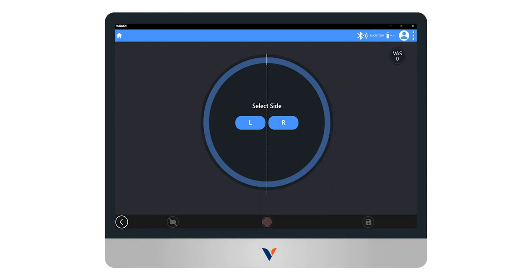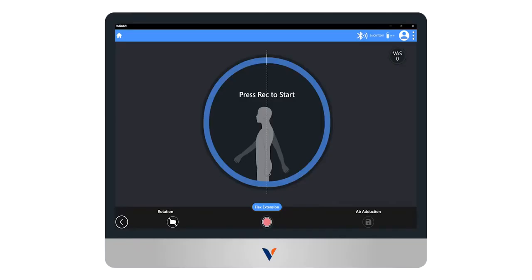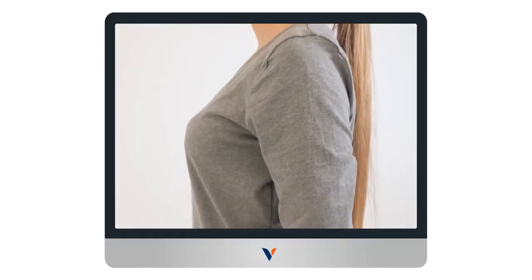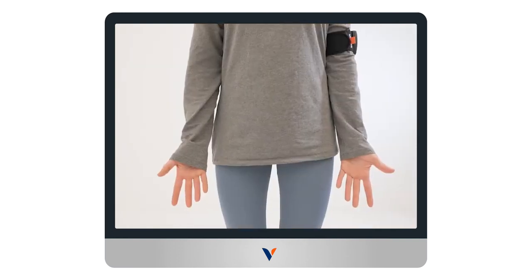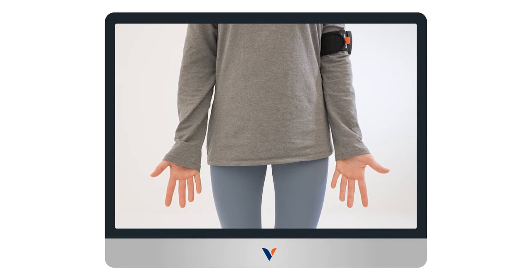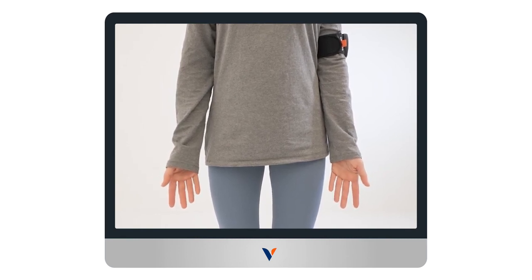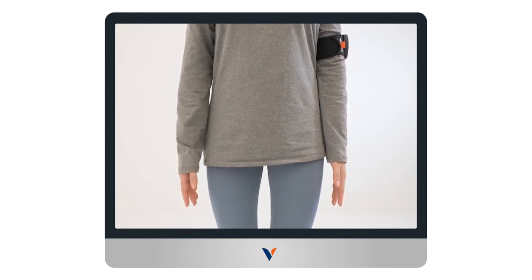In this example, we choose the right side. Then, select the first direction of movement that we want to evaluate, in this case, the flexion-extension movement. Starting from the orthostatic position, with the arms at his side and the elbow extended, the subject rotates the arm upward, bringing the palms towards the body. Then, have the subject return back to neutral position and rotate the arm backwards behind the body.